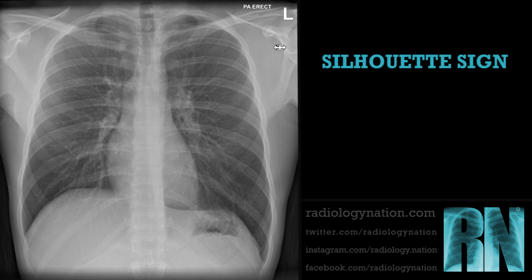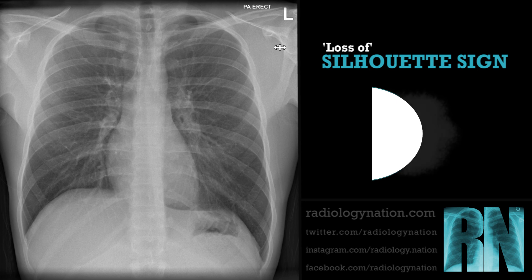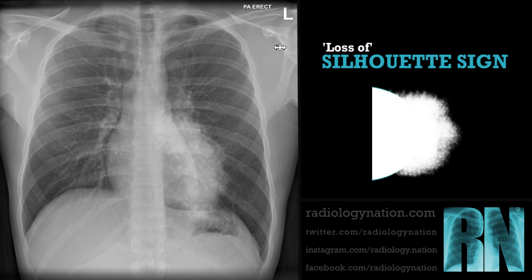When trying to determine which lobe the consolidation is in, we use the silhouette sign, or more appropriately, the loss of silhouette sign. We can see the mediastinal contour in a normal chest radiograph because the dense mediastinum lies against aerated lungs — it is the junction between air and soft tissue that makes the contour visible. When a material with a similar density to the mediastinum occupies the space next to it, the normal silhouette is lost. This is the basis of the loss of silhouette sign.